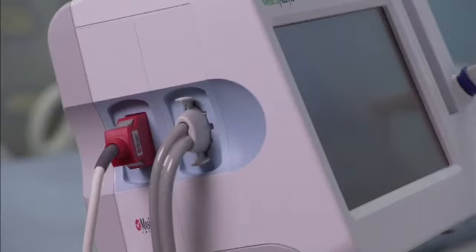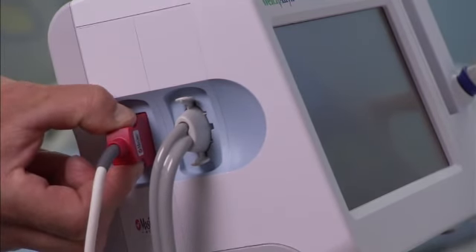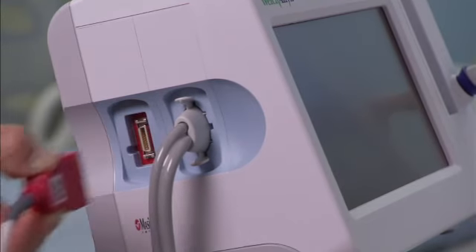To disconnect the SPO2 cable, place your thumb and forefinger on the cable connector, always grasping the cable by the connector, not pulling on the cable itself. Squeeze the side tabs until the connector releases. Pull the connector away from the connector port.